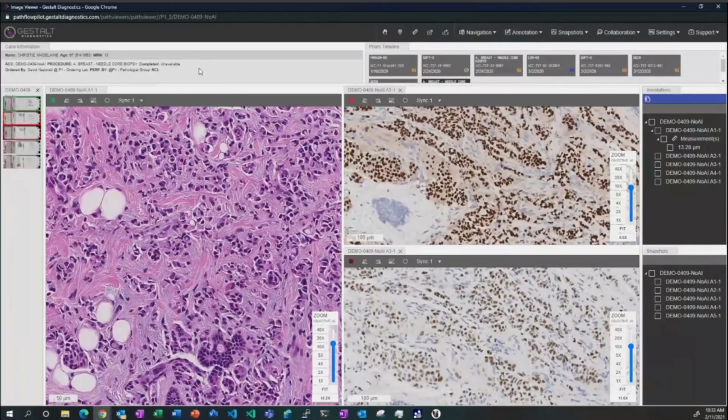And maybe when I get an F1 score set up for this pipeline, we can consider doing another follow-up presentation, more on the metrics. That would be great. I haven't been doing much experimentation with other backbones just because I'm not confident in my metric yet for comparing. So that's what I've been working on.